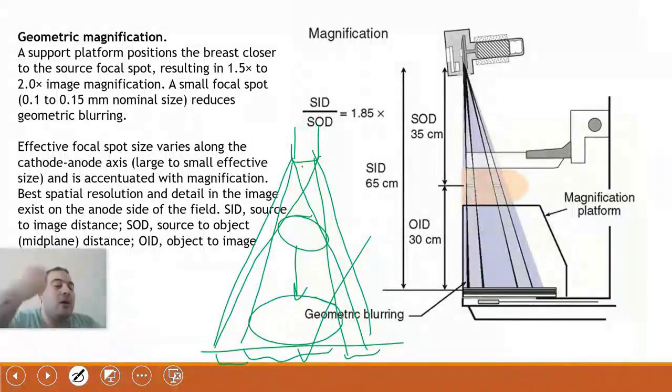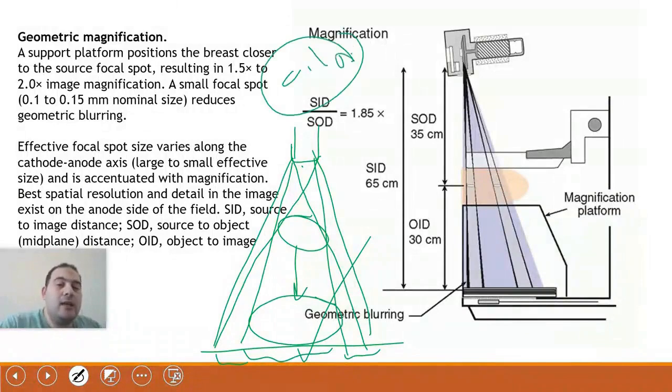To increase the resolution, I need to increase the factor. That will give me high resolution, so I use a low focal spot size of 0.1 to make my beam more focused and enhance the effect. Decreasing the focal spot size improves my resolution.